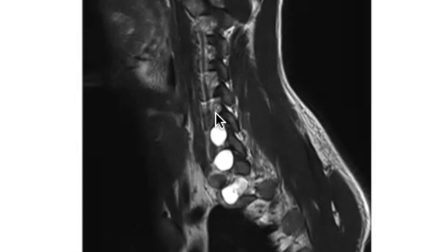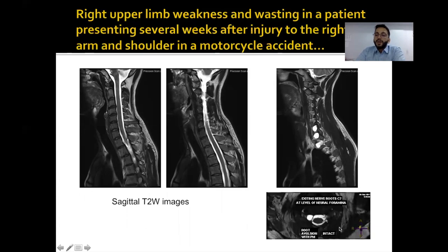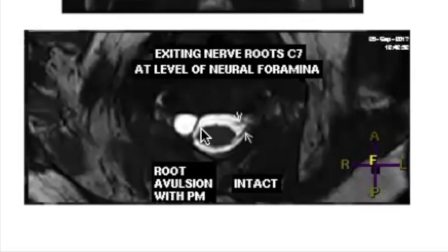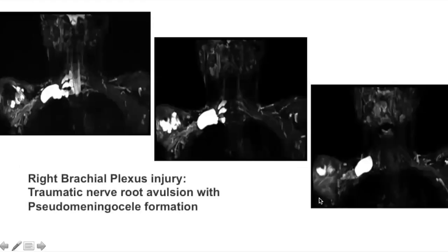The exiting nerves appear intact, but in the foramina there are cystic areas which could be traumatic pseudomeningoceles. On the axial 3D SPACE sequence, the ventral and dorsal rootlets are not seen on the right side at C7-D1, whereas they are seen on the left side — indicating complete nerve root avulsion of the right-sided C7 root with formation of a traumatic pseudomeningocele. The 3D STIR sequences with reformations clearly show the traumatic pseudomeningoceles at C6-7, C7-D1, and D1-2 levels, involving the roots.